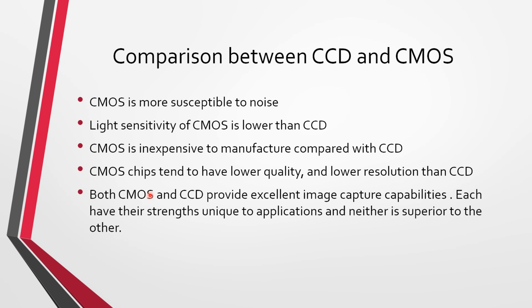Again, to go back to the beginning of the video, all this stuff is kind of hidden from us. We may not know which type of technology is used inside the detectors we use every day, doing hundreds of x-rays with. But there are trade-offs between any technology that's being used.